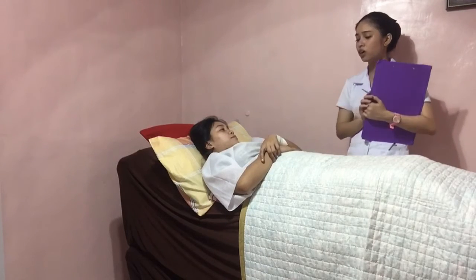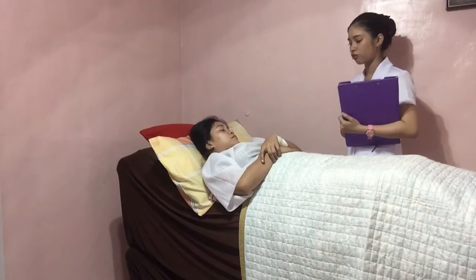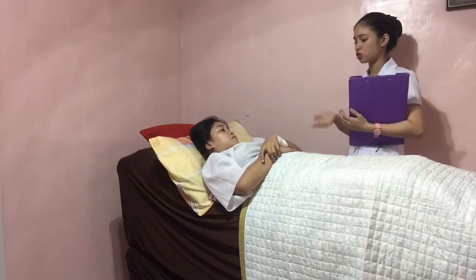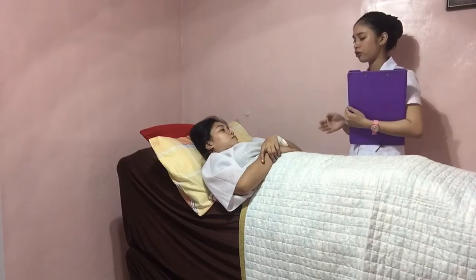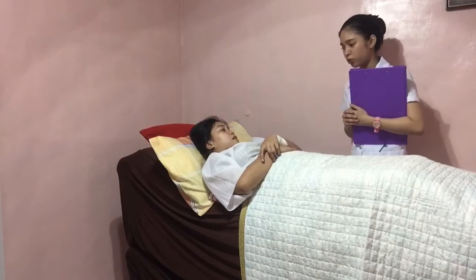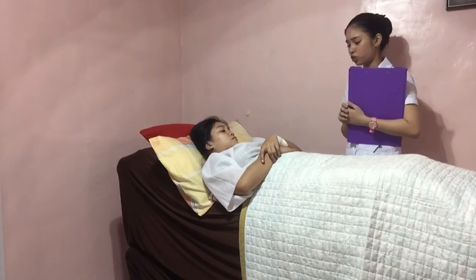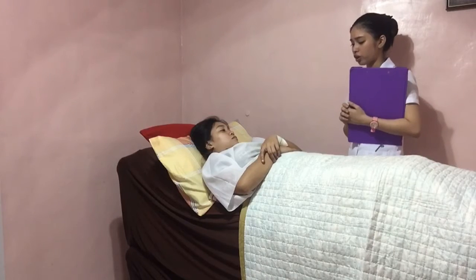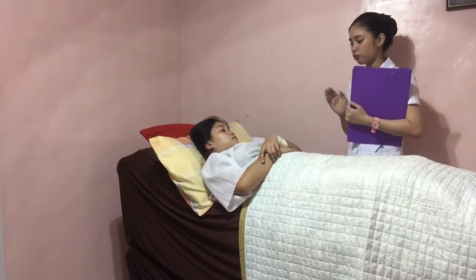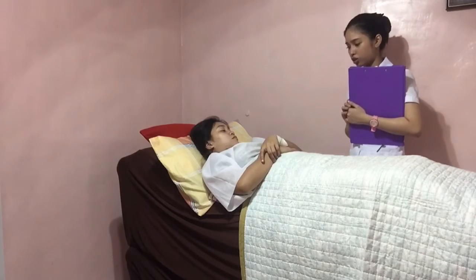Anything you want. Okay, so Althea, the procedure that I will be doing is that I'm going to take your vital signs. So I'm going to touch some parts of your body, and of course, there are a lot of procedures or movements that you should follow. Is that okay with you? Yes, ma'am. Okay, so if you feel uncomfortable, feel free to raise your concerns, and of course, some of the information that I will be getting is secured and safely handed to the doctors.